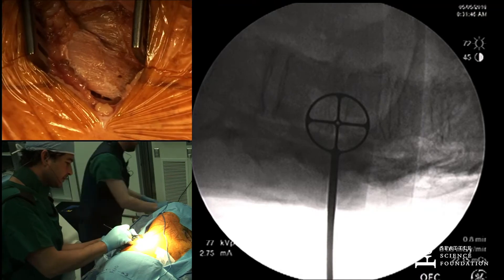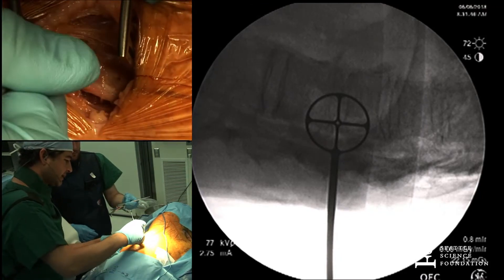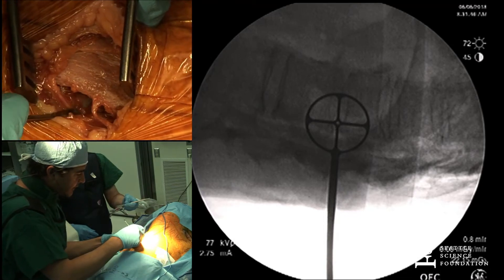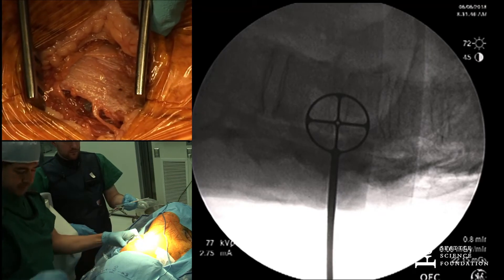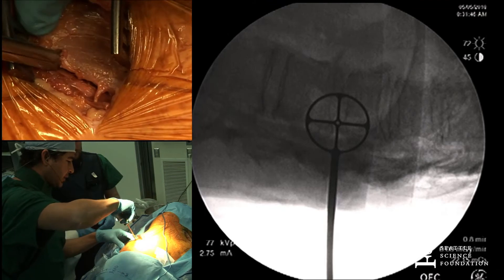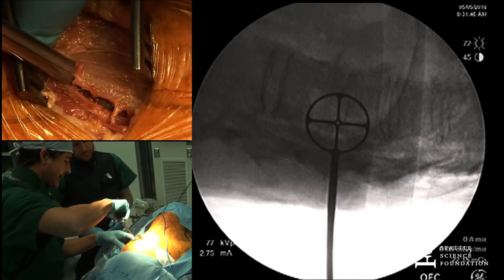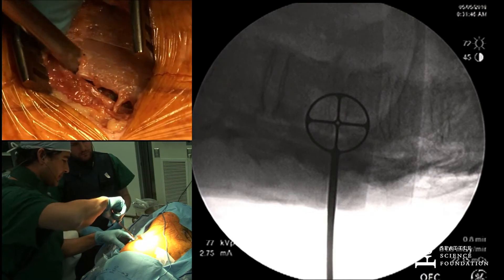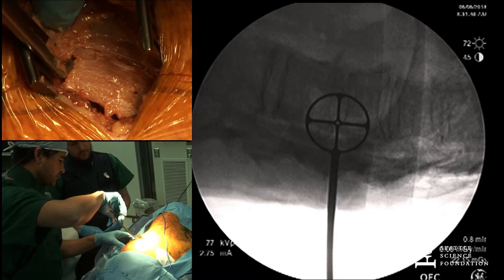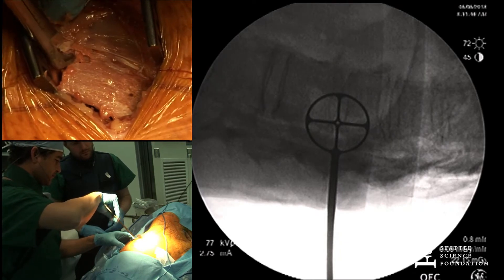Normally we use thoracic instruments — we've got a Doyen in here. I typically try to really undermine everything and get as much of the rib as possible because it's just going to get in the way when you put your retractor in. You can start to see the pleura right there, just underneath my instrument. I'll do an osteotomy across the rib and come all the way across it. The other instruments in the set include the Alexander, which is a periosteal elevator that separates out on the other side, and they have a rib cutter too, which works really well.